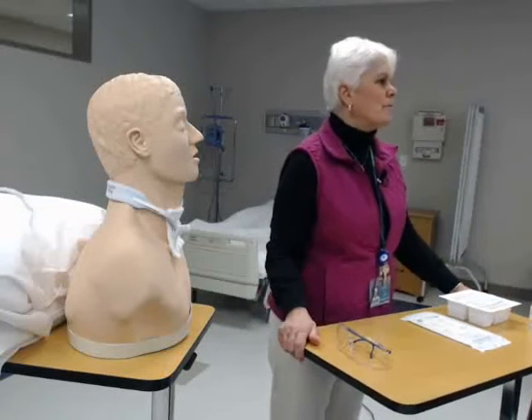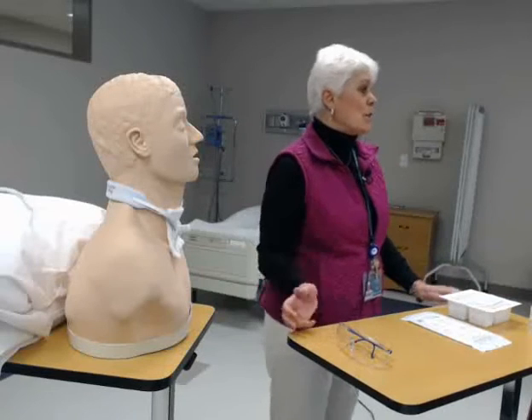Alright, we're going to start everyone. This is a demonstration on tracheotomy care.